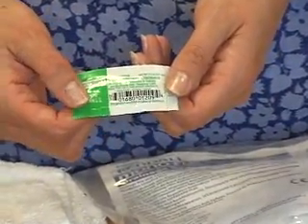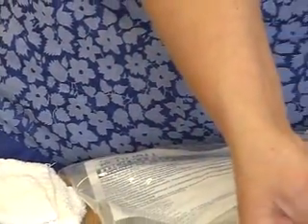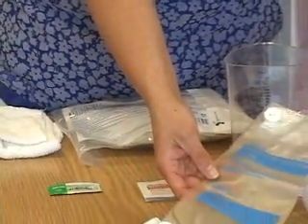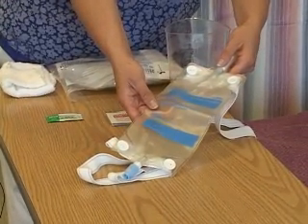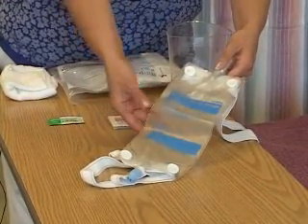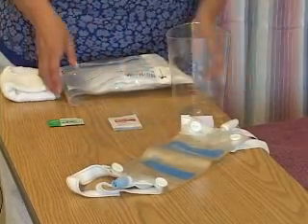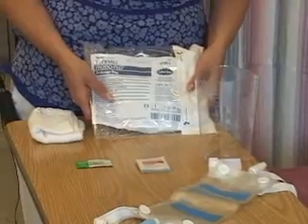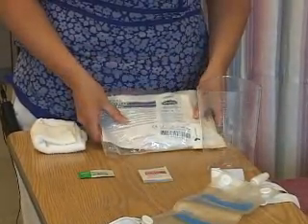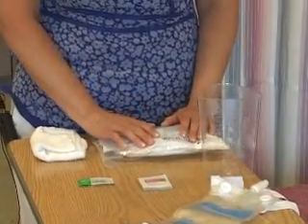In this video, I'm going to show you how to connect from the nighttime drainage bag, which you see now at your bedside, to this leg bag, which will help you promote resuming your daily activities. We'll also send you home with a new nighttime drainage bag to use at home while you are in bed. First, let me talk about hygiene.